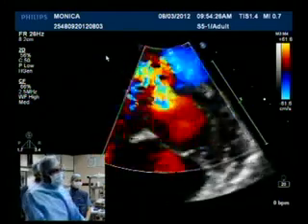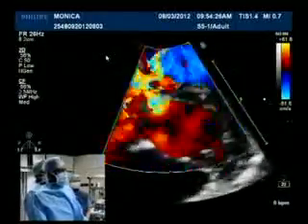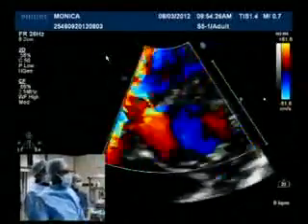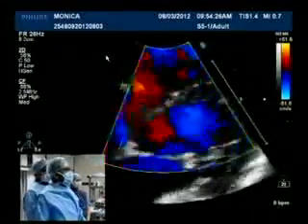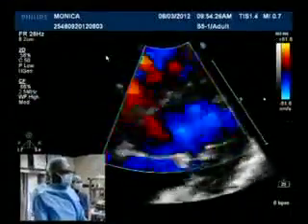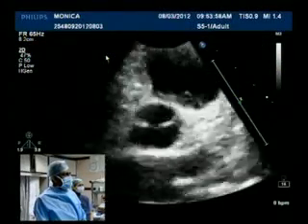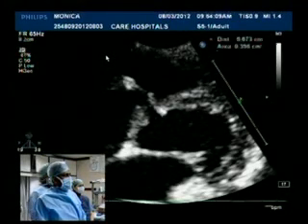So what size are you taking, ADO2? We have available sizes from 3 to 6, that is 3, 4, 5, 6, with 2 lengths, that is 4 and 6 lengths. Since the septum at that particular position is 4 millimeter, a 6-4 device should be okay here. It should be appropriate. And you have ensured that it is well away from the aortic valve? Yes. So you can show, Sudeep, that is where the VSD is. So it's well away from the aortic valve, isn't it?